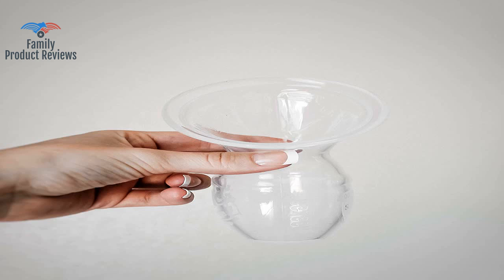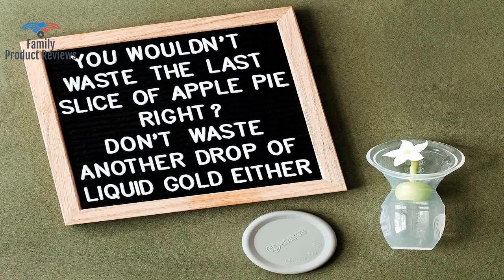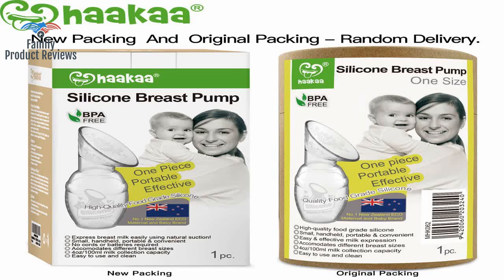They can fall off if not on perfectly, or if a little foot kicks them off. If you know a new or expecting mom who plans to breastfeed, get her one.